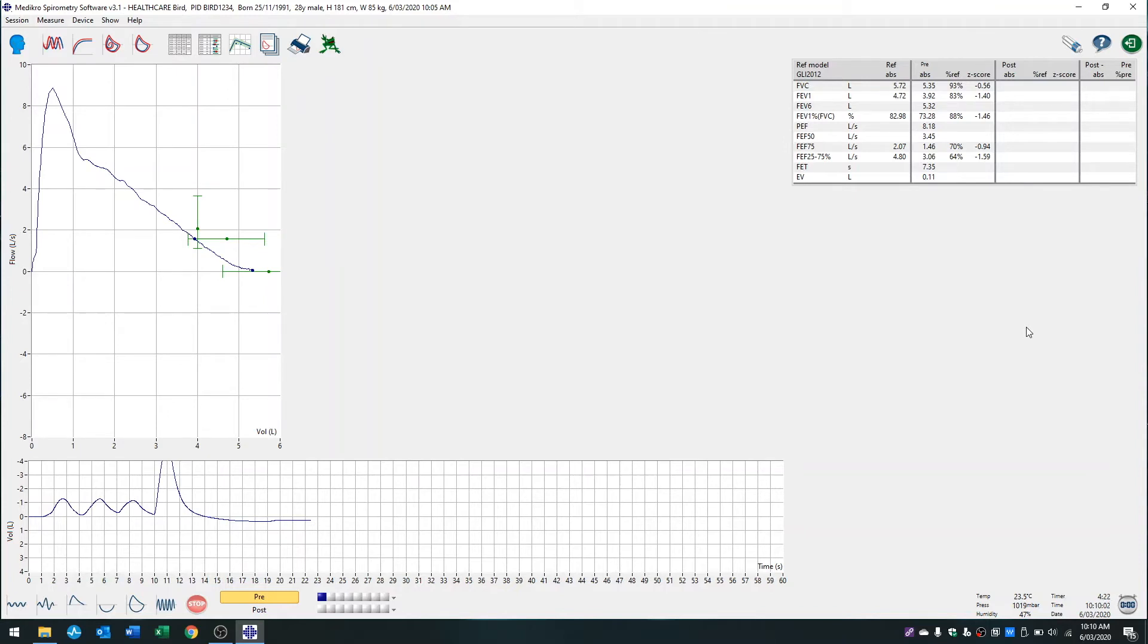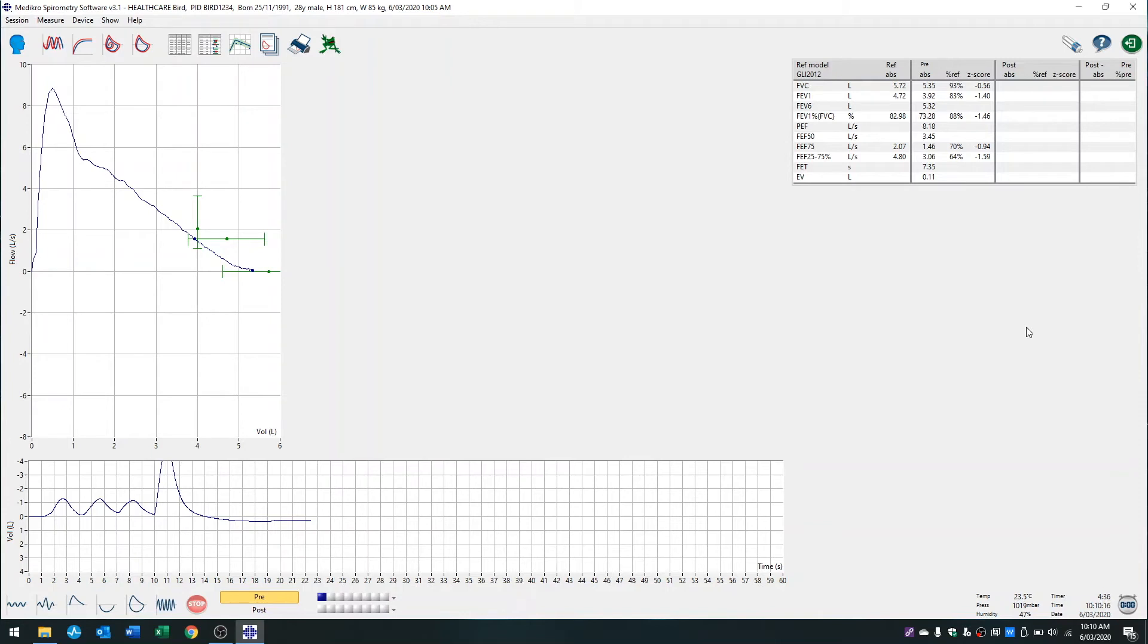My preferred method is to tell the patient to insert the mouthpiece into their mouth, to tidal breathe or breathe normally for two or three breaths, before taking a big breath in as much as they can, and then blasting their air out hard and fast all the way until they're empty.